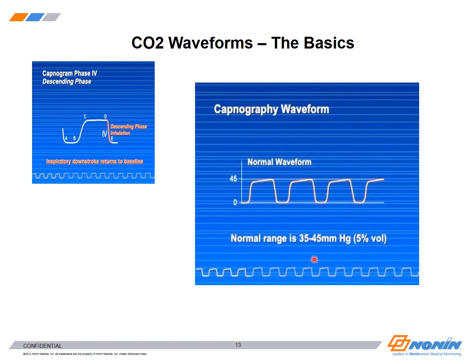So we see as we come out of D phase back into this E phase here, and then into A phase, this is basically your inhalation right here. So you want to see a rapid decrease in the amount of CO2. And this is what a normal waveform looks like. Nice little tilt there, moving to maximum end-tidal. This is your equilibrium. And the normal range is anywhere from 35 to 45. You get a lot of questions about this, so just keep that number in mind.